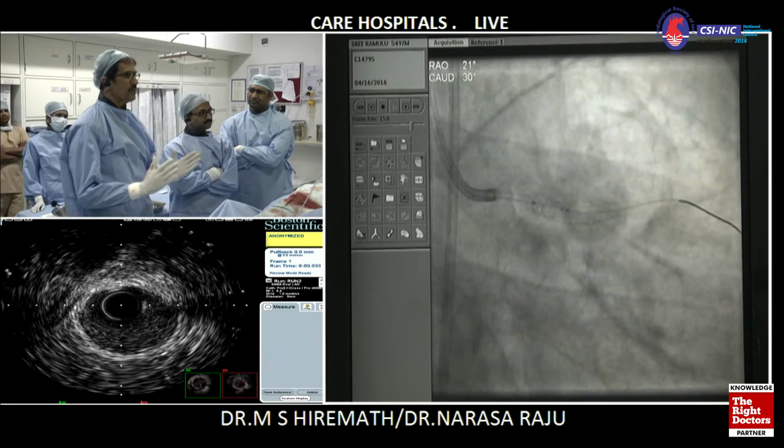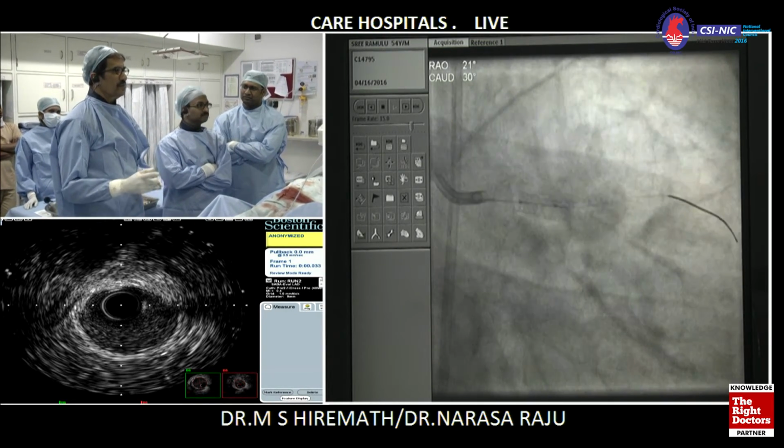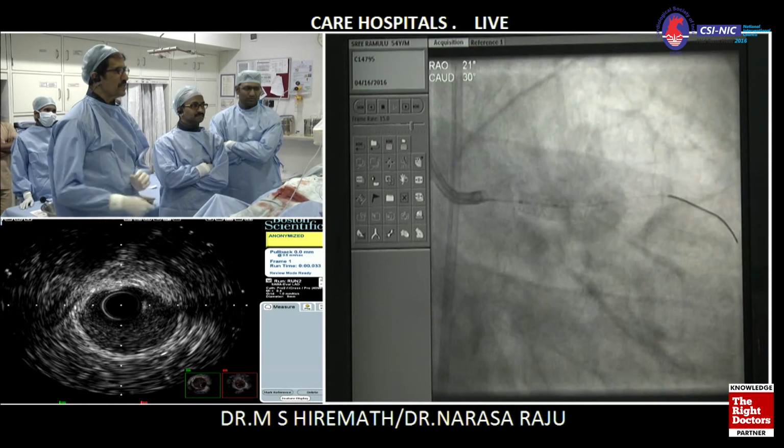So this stent has the ability to be stretched. This was a 4.0. The Ultimaster could be stretched to 5.3. This was a 4 into 8 length NC balloon. This is an Abbott balloon, NC Trek. The distal part of the stent was dilated to about 10, 12. Proximal, we went to 26, 28. And we will now show you the images, angio.